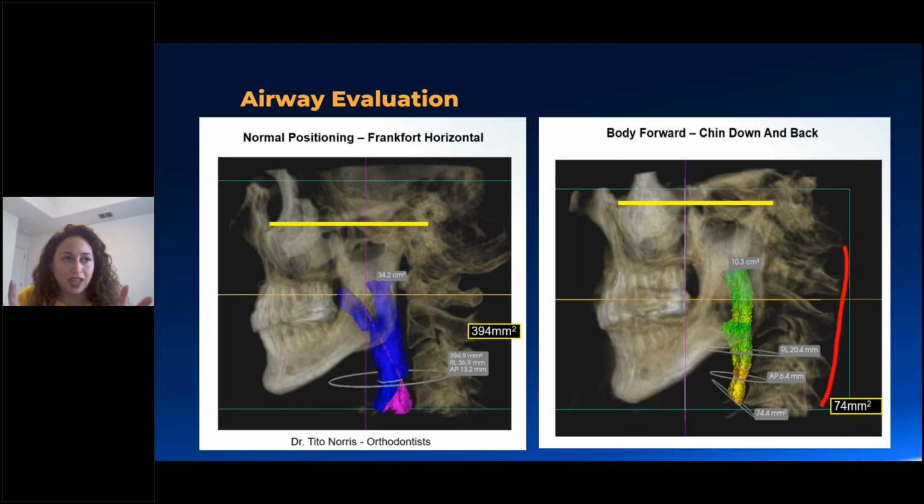So in this example, if you want to evaluate the airway of a patient, it's best to make sure that the neck is straight, the shoulders are straight, the patient's tongue is touching the roof of the mouth, and you can sit them down or have them stand up. I think if they're seated, they are much more stable. I would prefer sitting. If you have the 9600, sit down your patients regardless why you're taking that scan, especially if a patient has tremor.